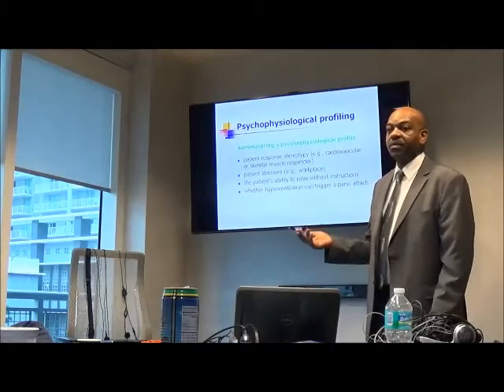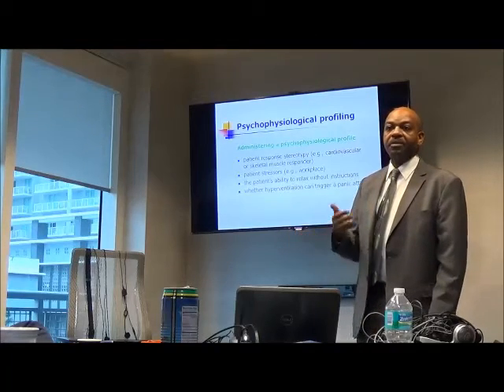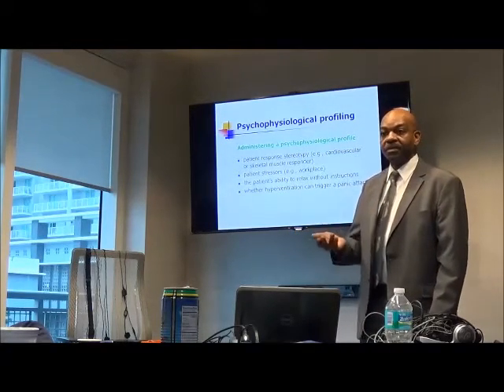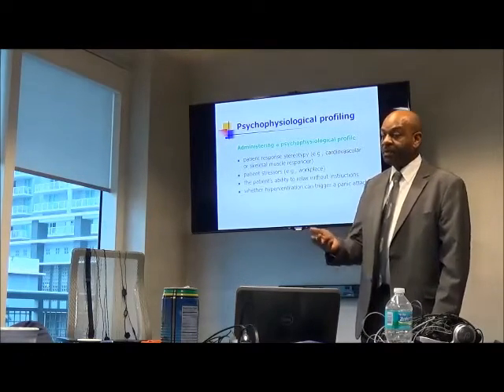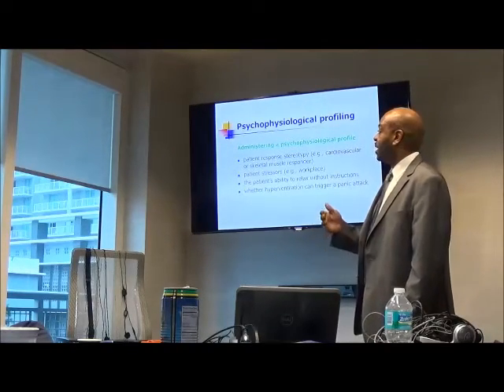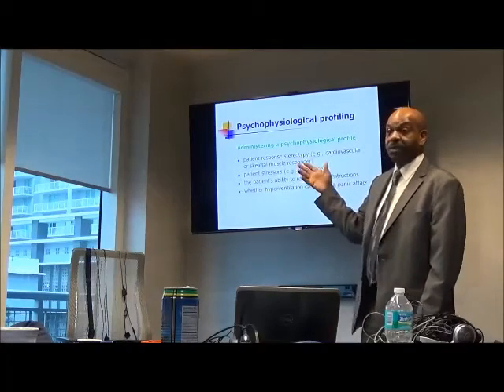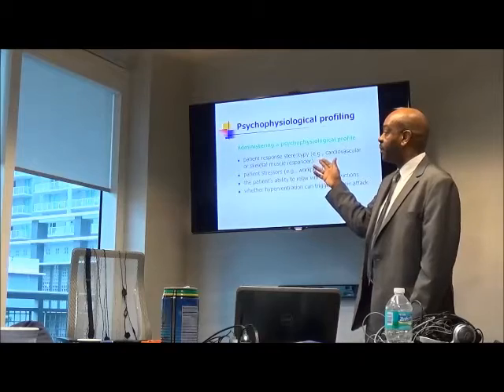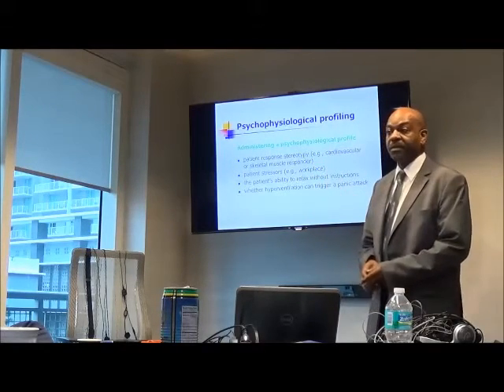So if you have someone with anxiety, you may see more things related to their breathing or to their skin conductance or their temperature changing, or maybe even their heart rate. Whereas if you have someone with pain, especially if it's muscular pain, you may see more changes in the muscle activity.